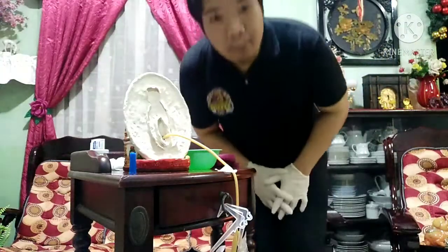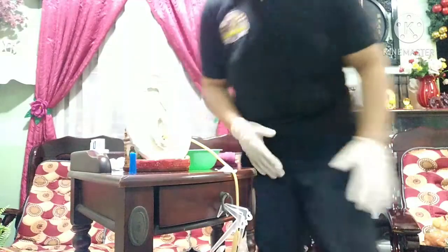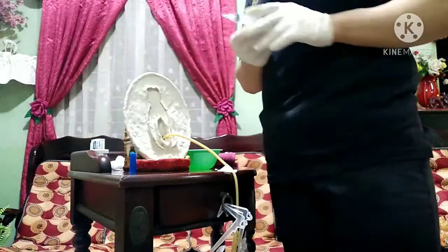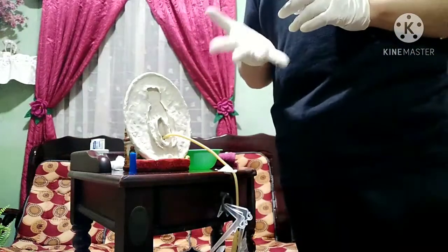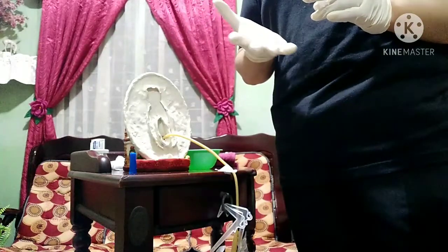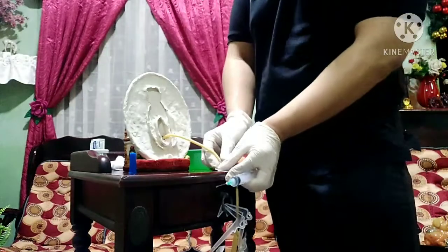Ayun po, nandito na po tayo sa ating removal po ng ating indwelling catheter po. So, step po is empty the balloon by inserting the barrel of the syringe and withdrawing the amount of fluid used during inflation po. So, aalisin na po na. So, ayan.